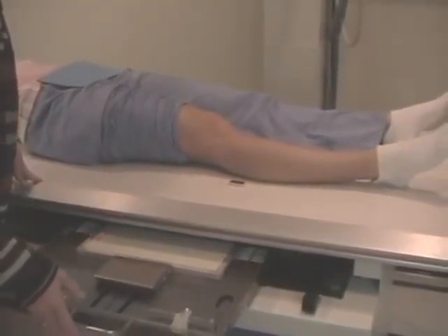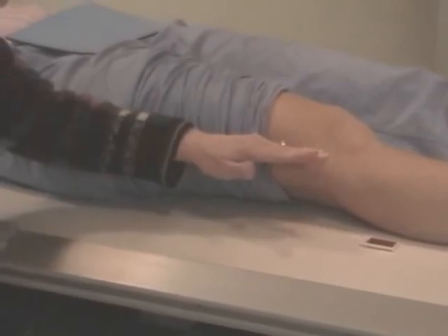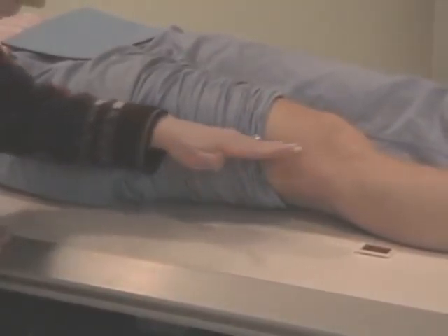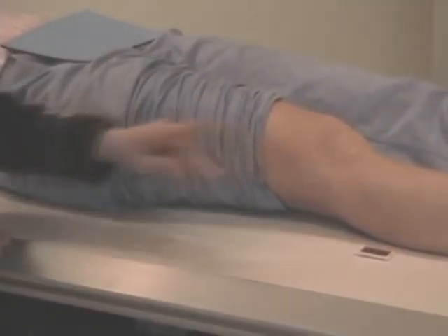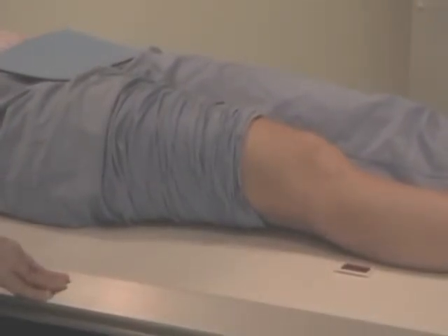Before we actually go to position the patient, I want you to look at her body habitus for a second. You need to analyze the femur and look at how it's fairly parallel to the table. I also need to explain that you're going to be working with technologists who've been trained in previous years with previous editions of the Ballinger textbook in positioning.